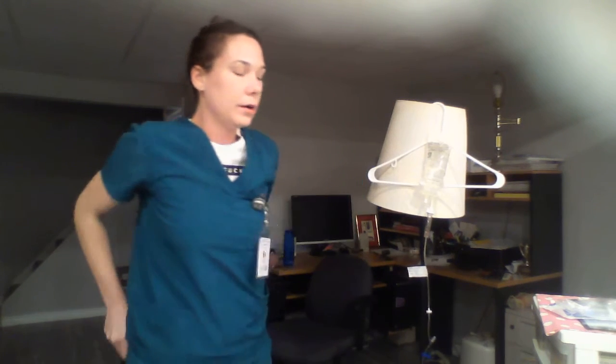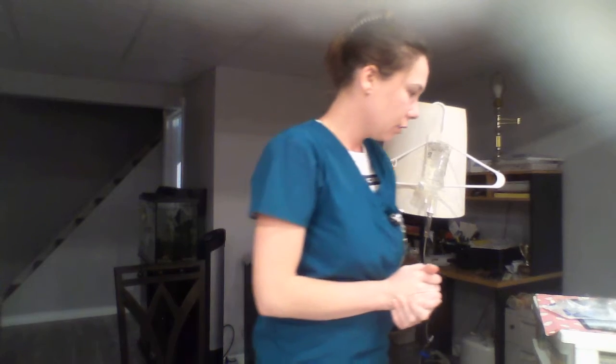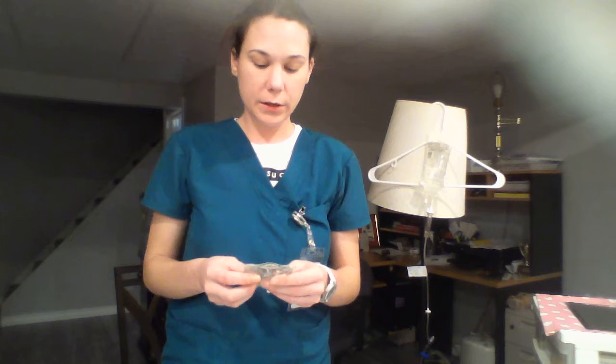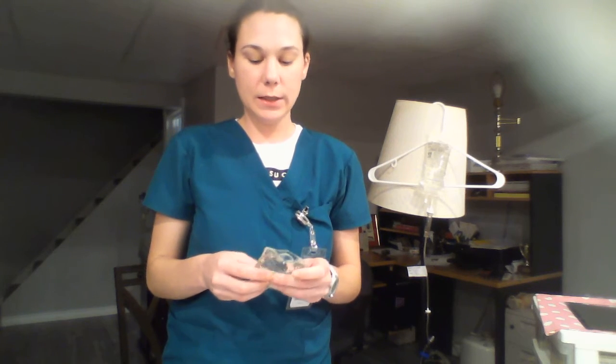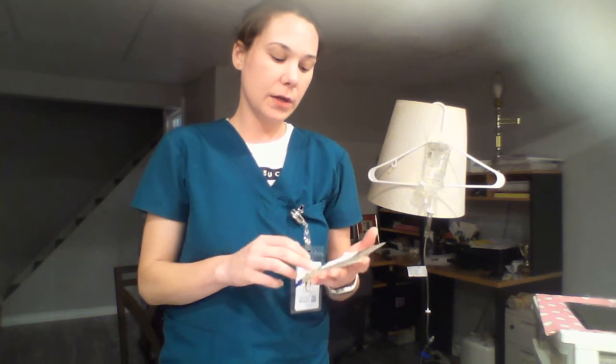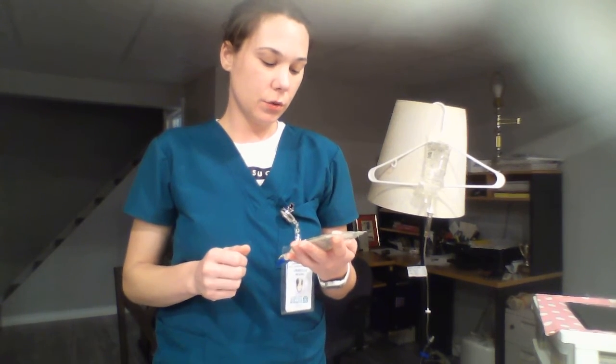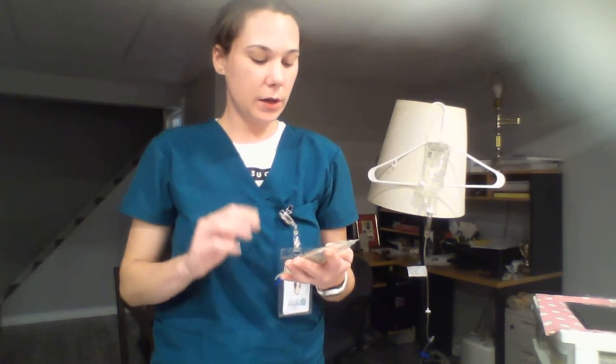Okay, so I am going to go over and I'm going to grab my medication. And I'm going to grab my second line. I'm going to inspect this bag for color, clarity. I want to check for any leaks. I also want to check the expiry date on both the bag and the order. January 2021, perfect. August 2028, perfect.